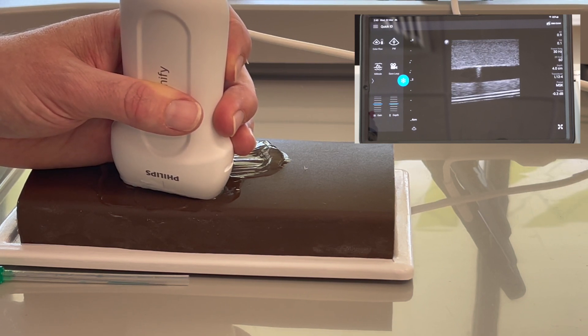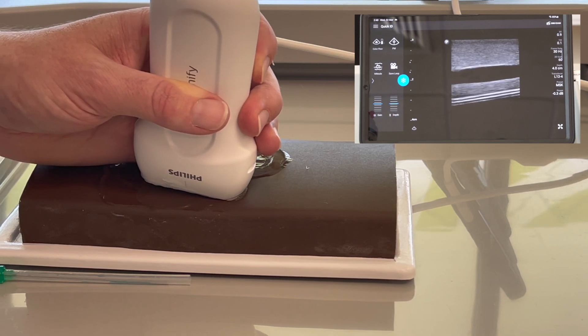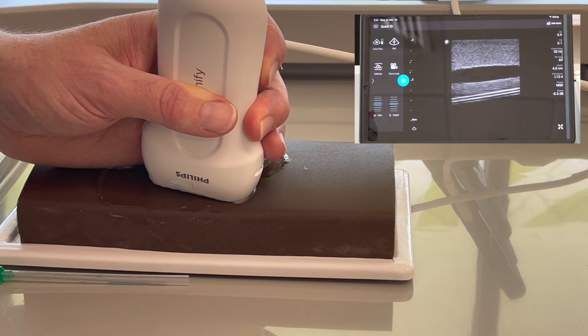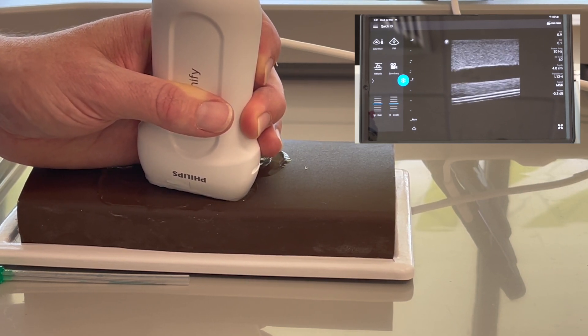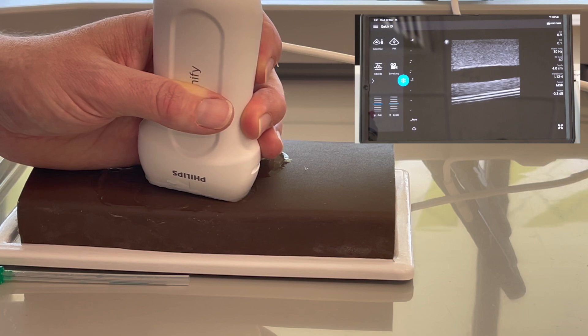There's a little echo in this training gel, and the more the training gel gets cannulated, the more you'll end up with those abnormalities. So being able to identify in a training arm or training gel what is your needle tip and what is not is important.